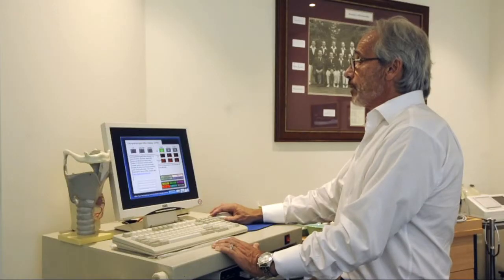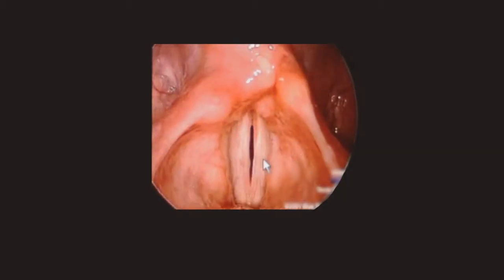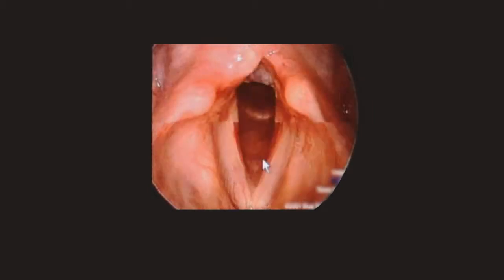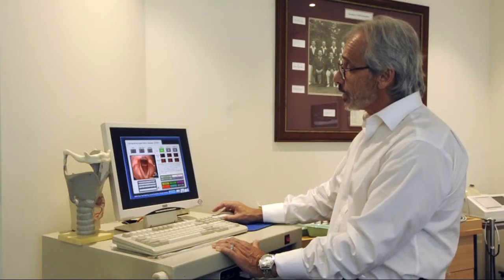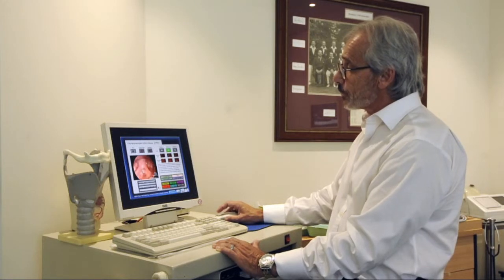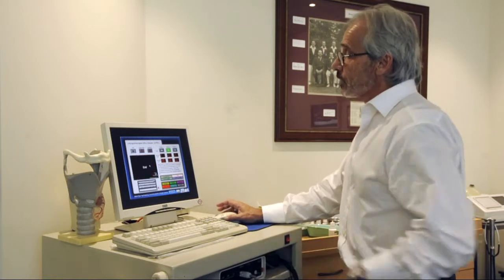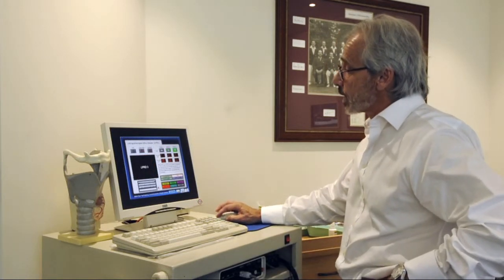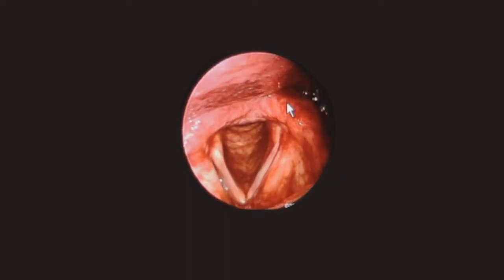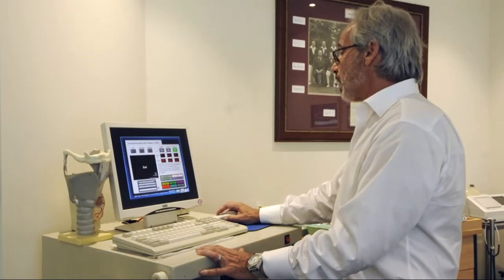Reflux-induced pharyngolaryngitis, or changes in the larynx associated with reflux, are very common. You can see here that there's an increased vascularity of the cords — they're redder, they're thicker, and the surrounding area is also inflamed. In patient two, you will notice that the lining is thickened at the back of the larynx and overlying the vocal cord due to the ongoing irritation of acid coming up from the stomach, irritating and soiling the larynx. These changes called reflux-induced pharyngolaryngitis are very common in terms of laryngeal disorders.